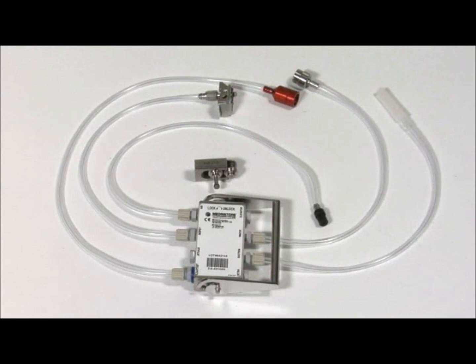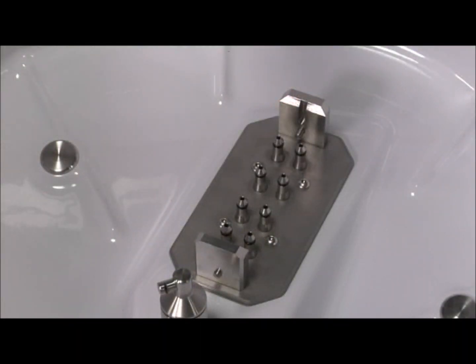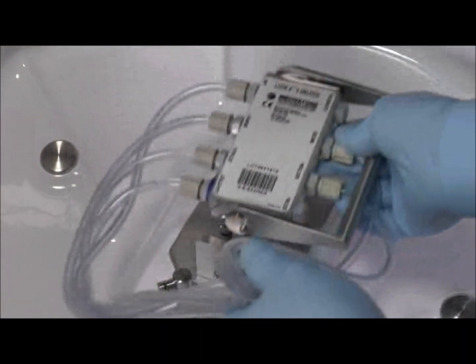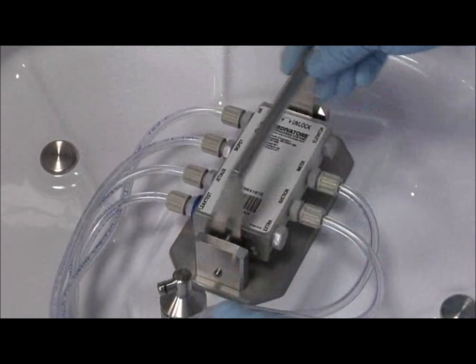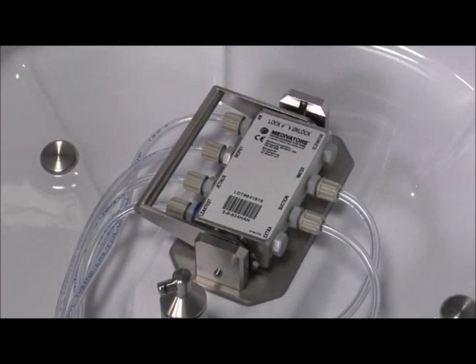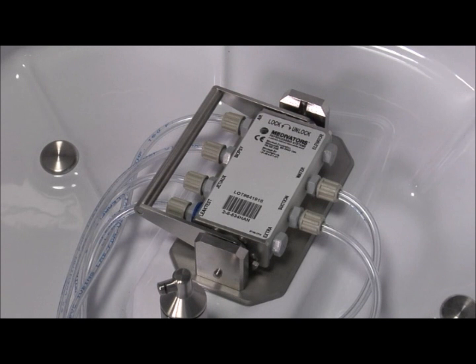Insert the hookup connector block. Place the block lightly over the manifold, making sure none of the hoses run or are pinched under the block. Lock the connector block in place by moving the handle to the left.